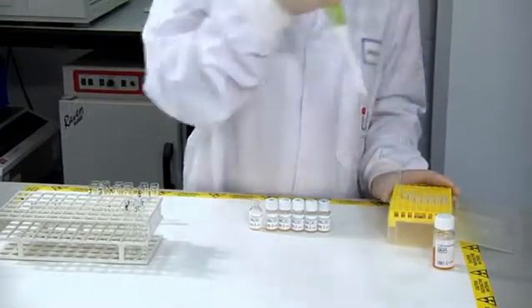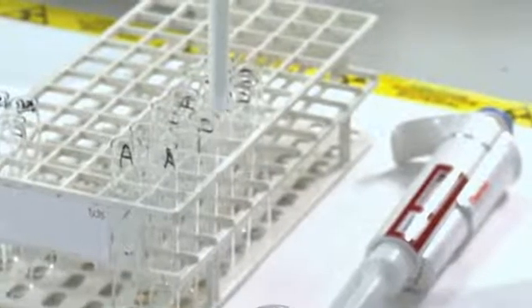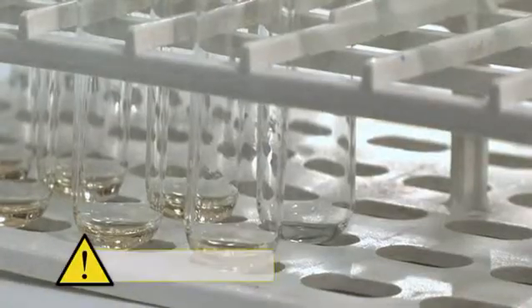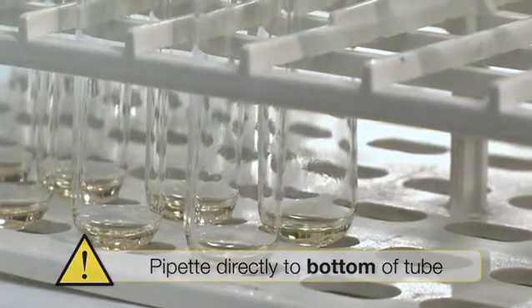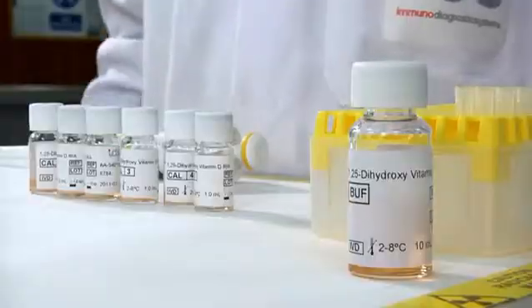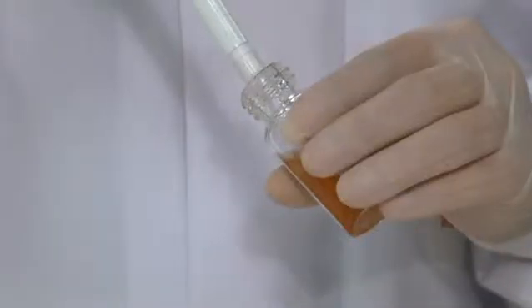Pipette 100 microliters of each calibrator into the relevant duplicate tubes. Ensure calibrators are pipetted to the bottom of the tubes and not down the sides. Add 300 microliters of assay buffer to each NSP tube.